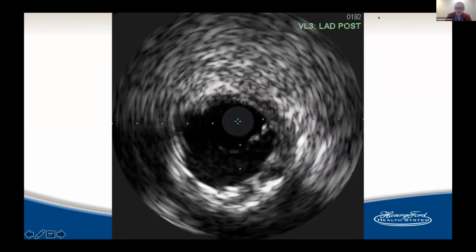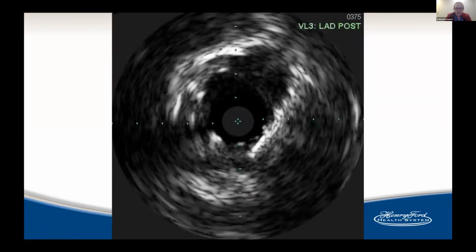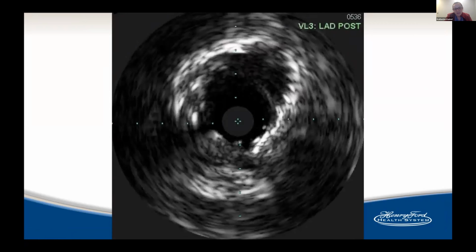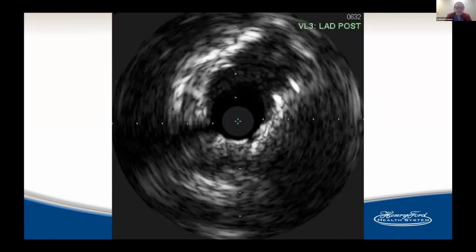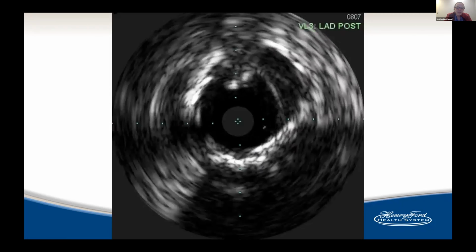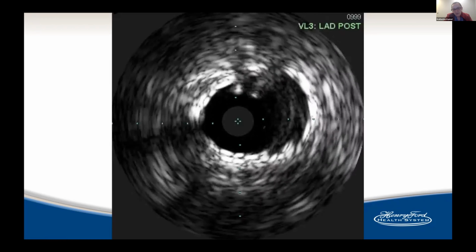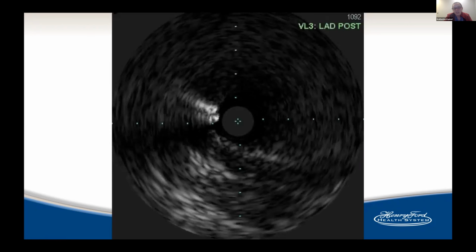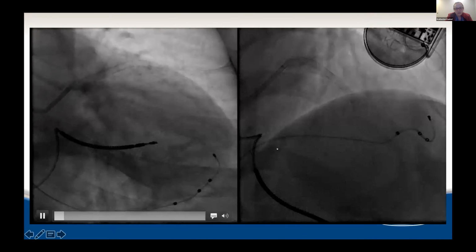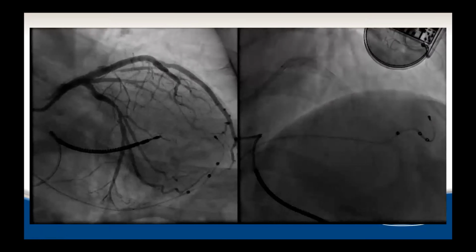And so you see here, now we have our distal stent edge that's well expanded. This was the area of significant calcification, and coming in, we're well expanded throughout this area. As we're coming back proximally, we're encountering more calcium. There we're at the ostial left main where you see that second stent coming in. Now we're going in and out of the proximal to mid left main, checking out that proximal stent edge, which looks well opposed and well expanded. And here are the final wire out shots. It's a really fantastic result.